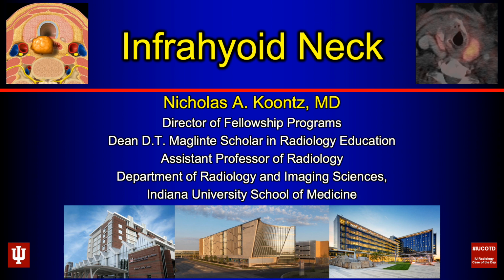The topic for today's talk is going to focus on the infrahyoid neck. And it's going to be a differential diagnosis-based lecture. So we'll run through the different contents, the different spaces in the infrahyoid neck, or at least the main ones, and talk about some of the different structures and some of the pathologies that can occur here.